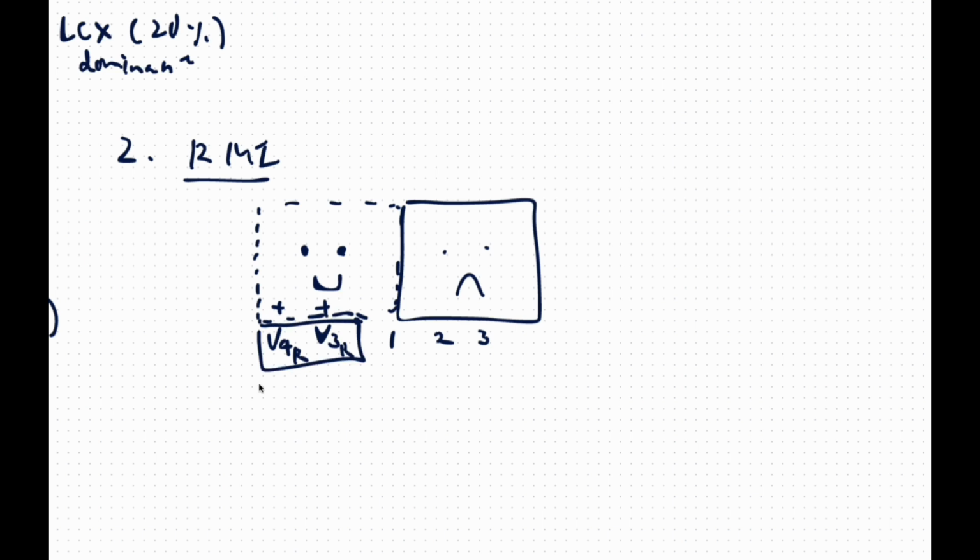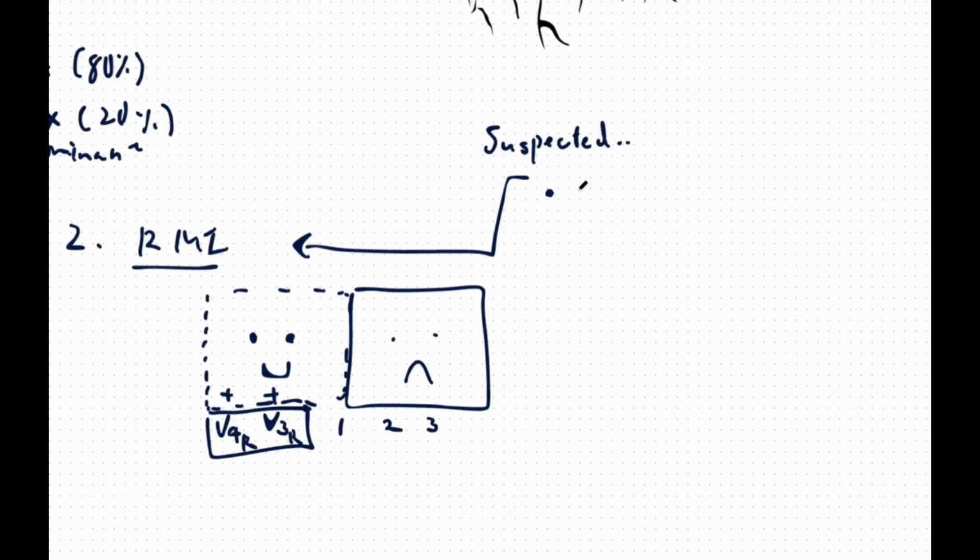So when should we suspect RVI? Let's briefly touch on some clinical situations. First, when V1 shows isolated ST elevation, the right ventricle lies anteriorly, so isolated V1 elevation suggests RVI. And when STEMI involves the inferior leads, 2, 3, aVF, 30 to 50% of inferior STEMI involves the right ventricle. Be especially cautious when lead 3 shows more ST elevation than lead 2.